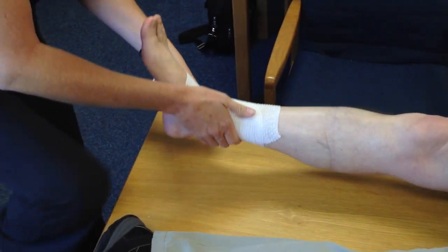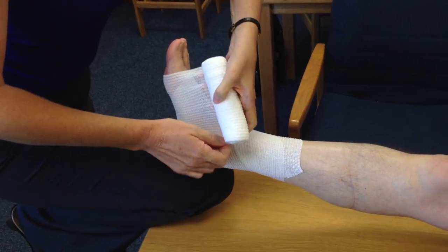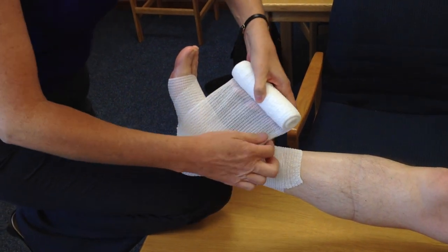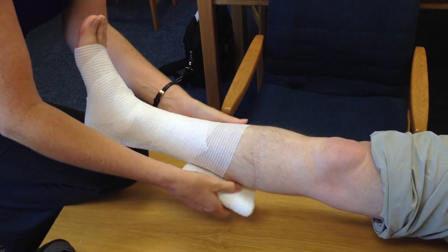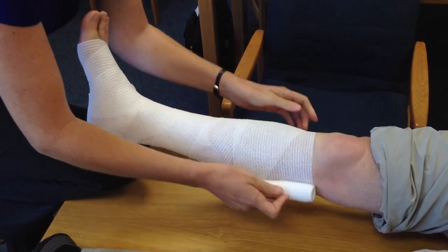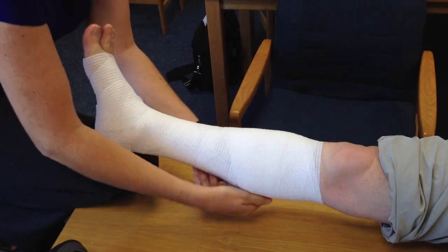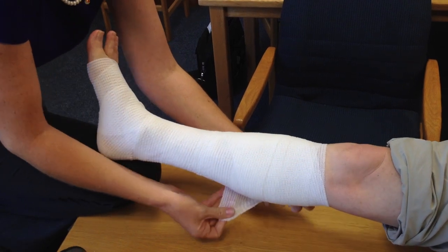Fixed on the ankle, and then worked down over the heel to the base of the toe, and back over the heel. You will see that the 150 millimeter width comes in very practical because the middle of the bandage is over the heel, so the chance that it will come open is slim. What you will see now is that I'm not stretching out this bandage — I am merely rolling it down. This is the technique from Charnley on applying plaster of Paris: following the anatomy of the leg rather than forcing the bandage where it doesn't want to go. With this system we have actually compressed and packed the calf well.